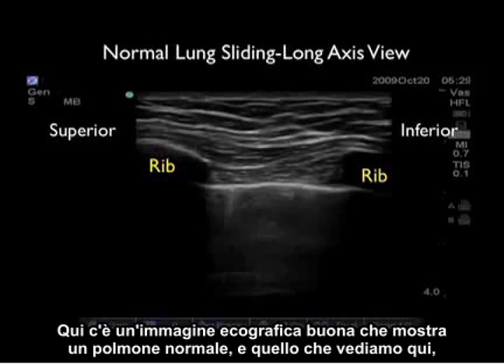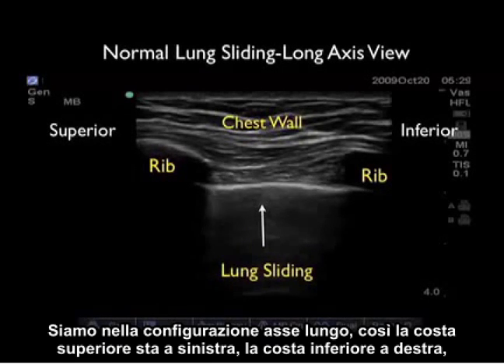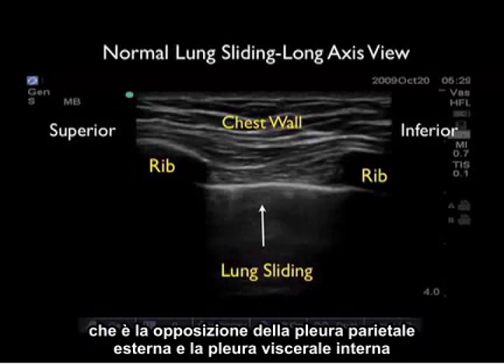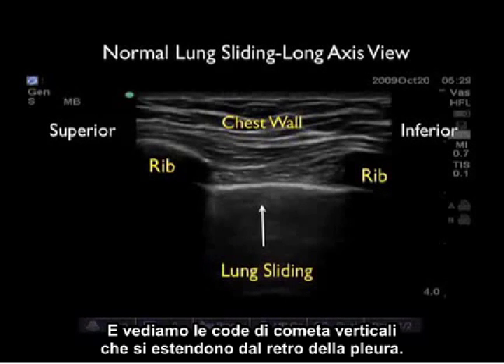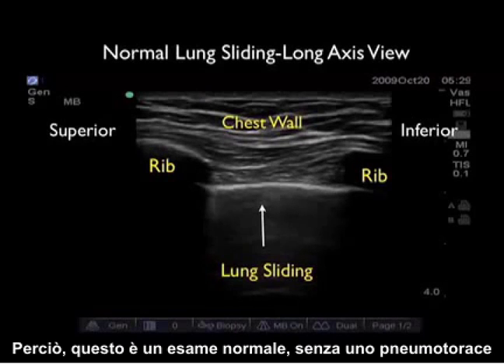Here's a nice ultrasound image showing a normal lung. We're in the long axis configuration, so the superior rib is to the left, inferior rib to the right, chest wall anteriorly. We see here the lung sliding, which is the opposition of the outer parietal and the inner visceral pleura. And we see the vertical comet tails coming off the back of the pleura. Thus, this is a completely normal exam — no pneumothorax.